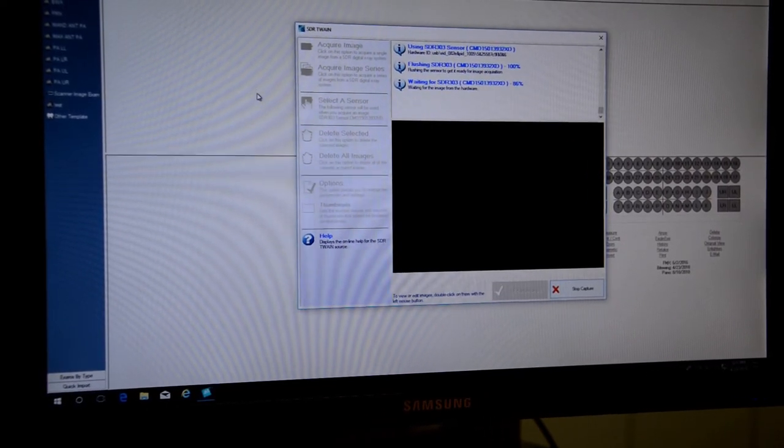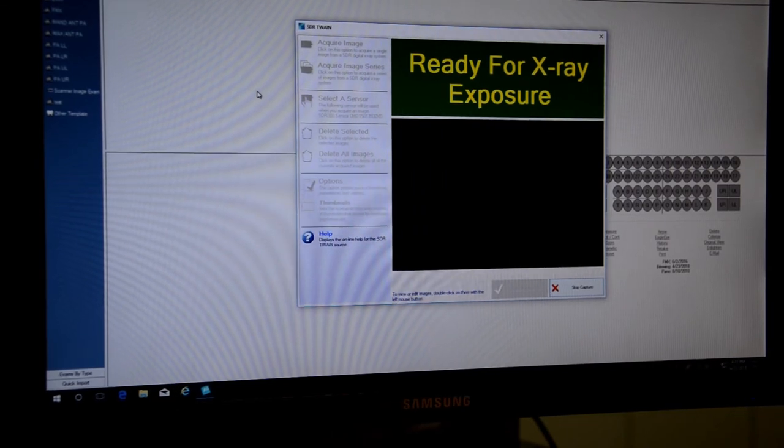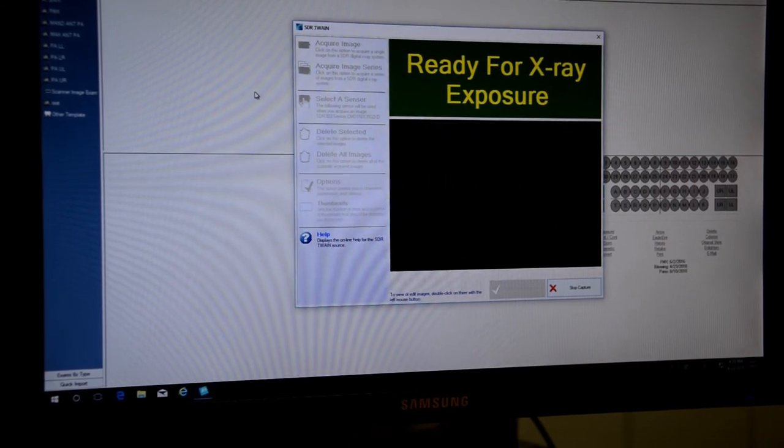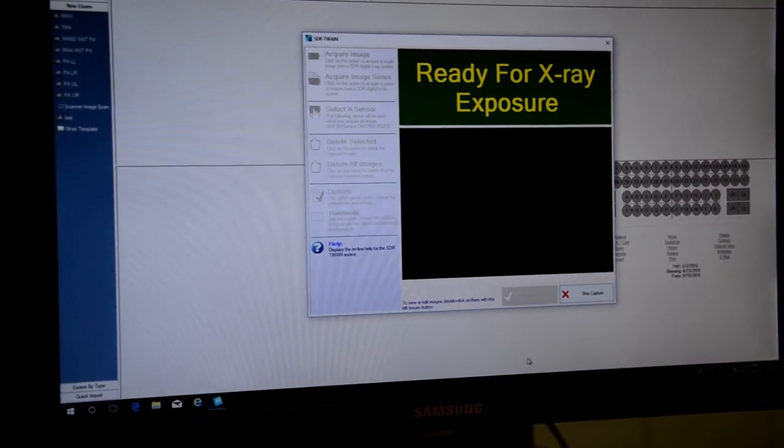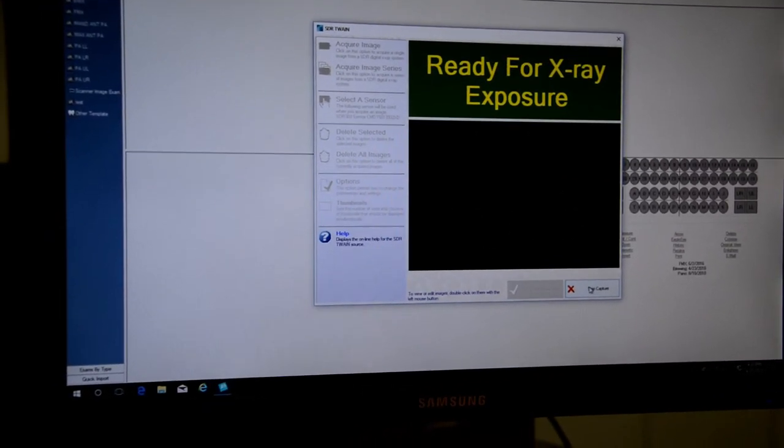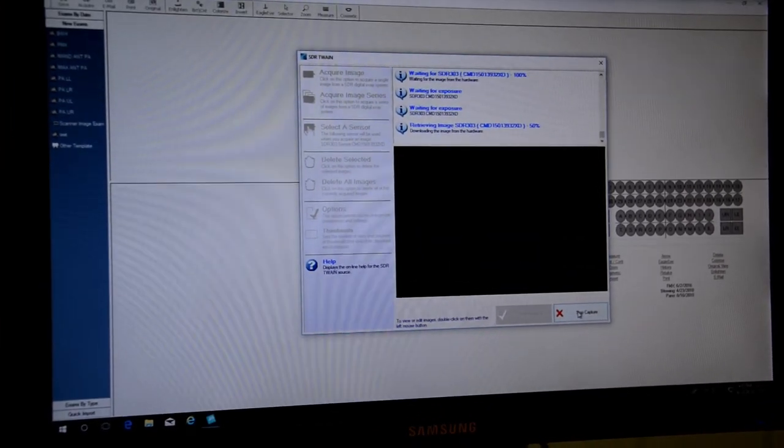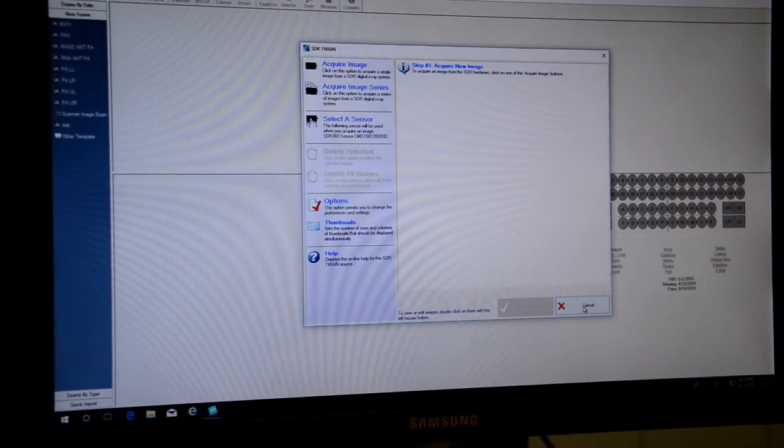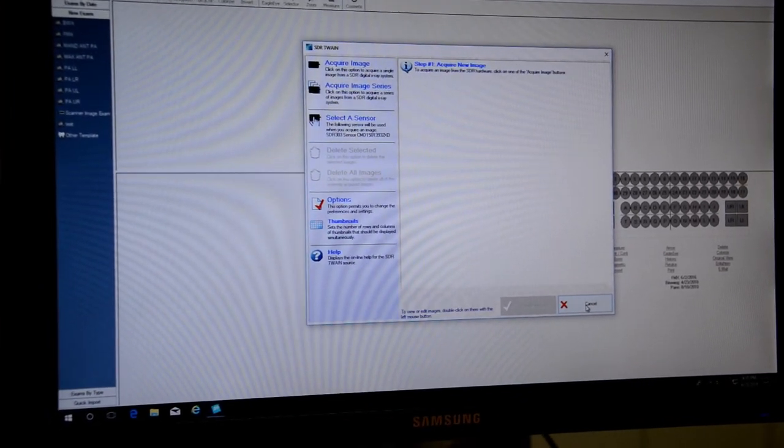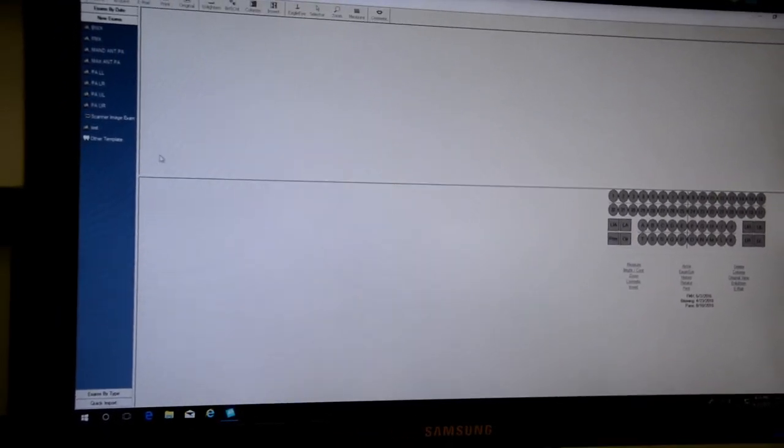This is going to be taking just a normal individual PA. If we just click the x-ray button. If we wanted to actually capture a series or a layout of series, a layout of images.